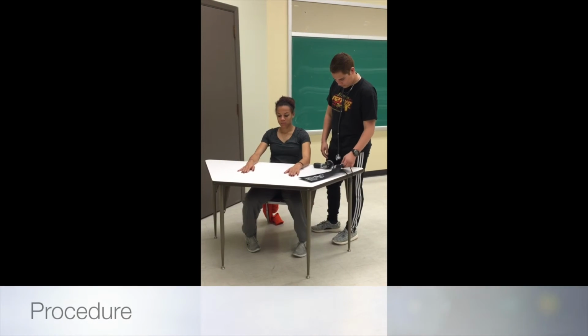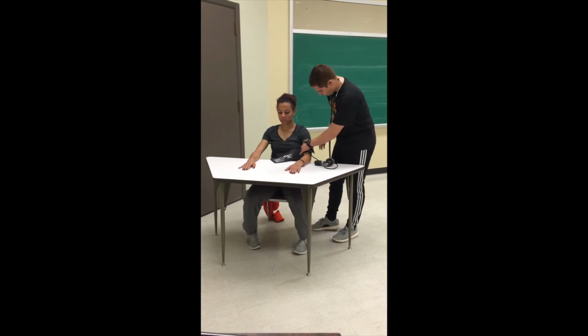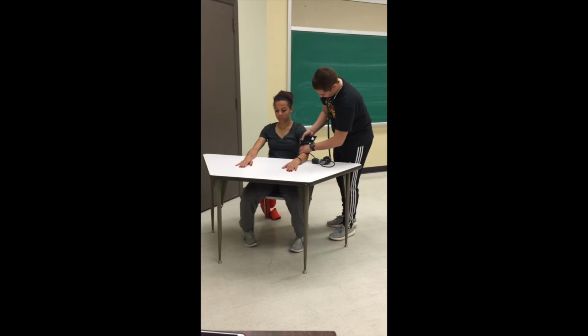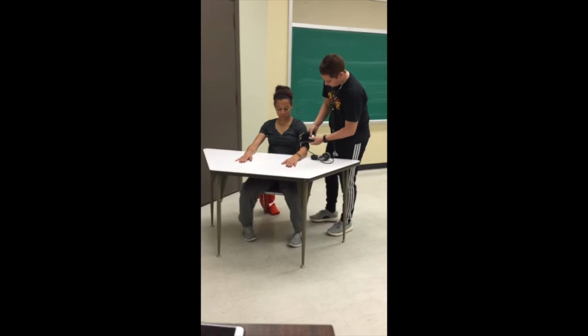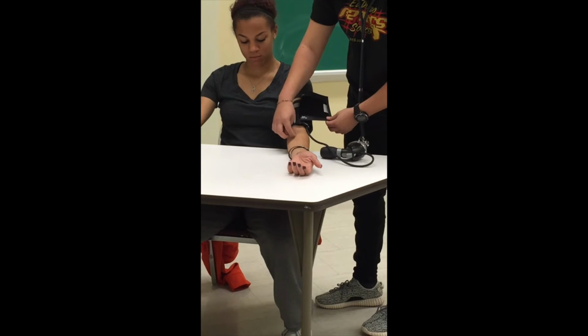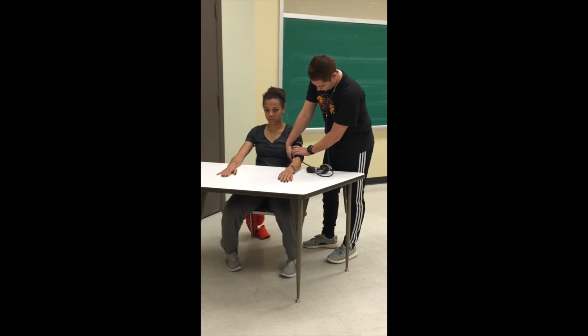You begin by placing the cuff around the upper left arm because the left arm is closest to the heart. This ensures that you hear the Korotkoff sounds clearly. The cuff is marked by an arrow that indicates the placement of the cuff at the brachial artery. Make sure that this arrow and the brachial artery align.